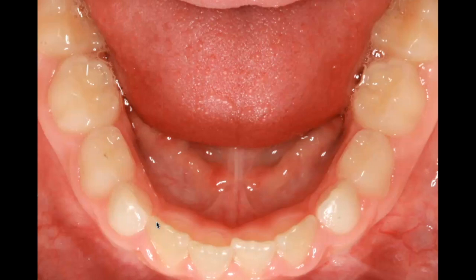Look at the teeth. One more thing about the teeth that you may want to keep an eye on. And you can't really see it as well from this picture as you probably will be able to from other pictures. The left primary first molar? Yeah, what's going on with that? Very good. Do you guys see that? Yeah, so that left primary first molar is a little bit lower, so we want to keep an eye out for what?